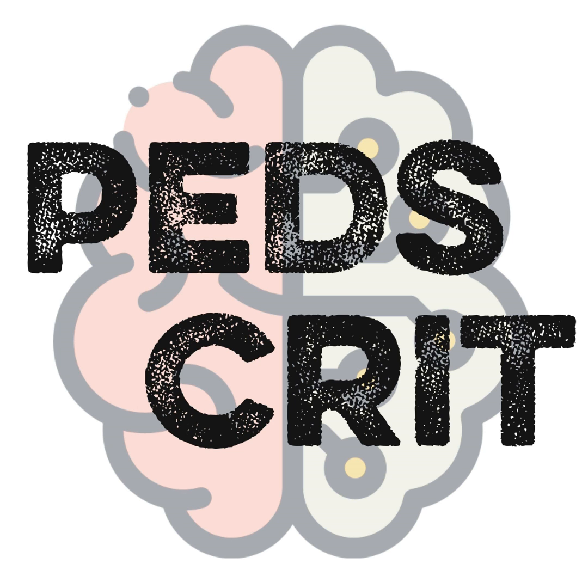Oh, absolutely. Sounds like such a precise measure of what the patient needs. And then if you lose it all with tiny nasal prongs or something, then I could see that being ineffective. So say you're delivering the pressure that's intended, but your patient, over the next couple hours after you've started NAVA, is still having work of breathing that's maybe moderate to even severe. Your electrical activity of the diaphragm is still high. How would you titrate that therapy? How much would you typically increase the NAVA level? At what time interval would you do that?